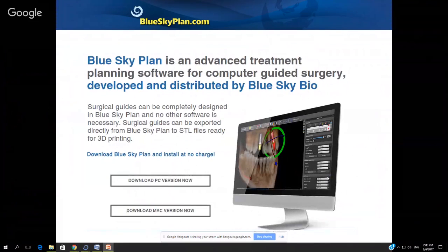For those of you who may not yet have downloaded the software, please go to blueskybio.com and download the software. Blue Sky Plan is an advanced treatment planning software for computer-guided surgery. It has a lot of great functionality in it. It's distributed free of charge. You can put on as many computers as you like.